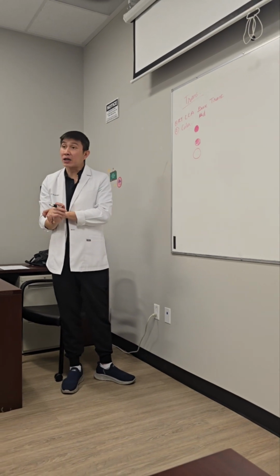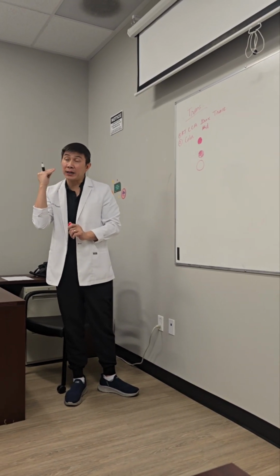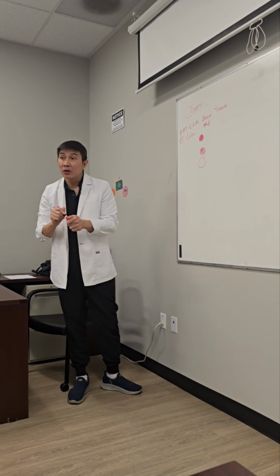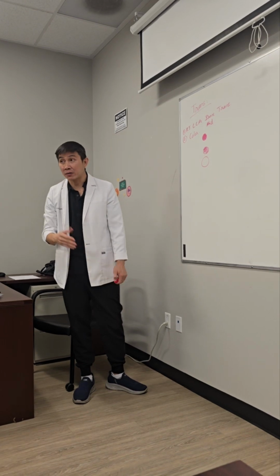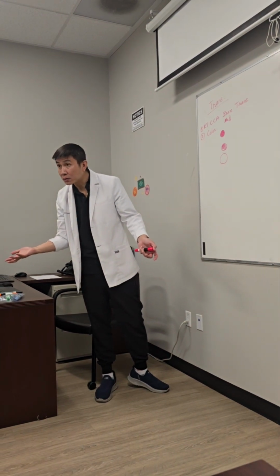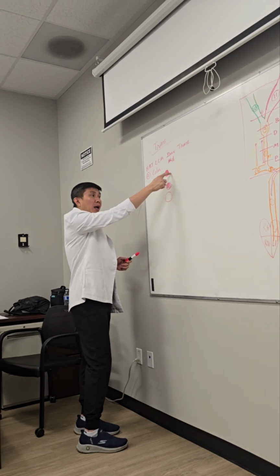Keep in mind the calcification, the pathology may happen anywhere when you sweep from the proximal to the bulb. And this is very important. With calcification you get stenosis. When stenosis happens, the blood going to the brain decreases, and that leads to what pathology? Stroke. That's the reason we need to scan the carotid. So this is proximal, mid, the same, and then distal.